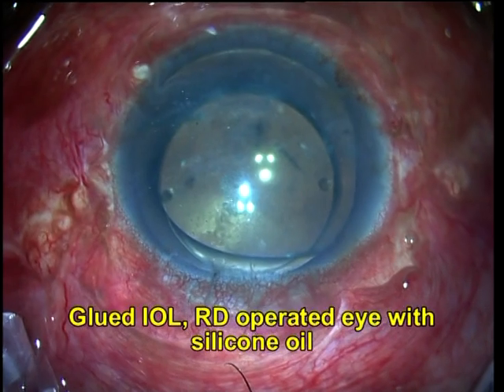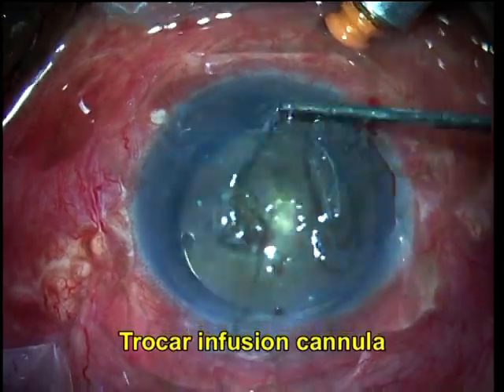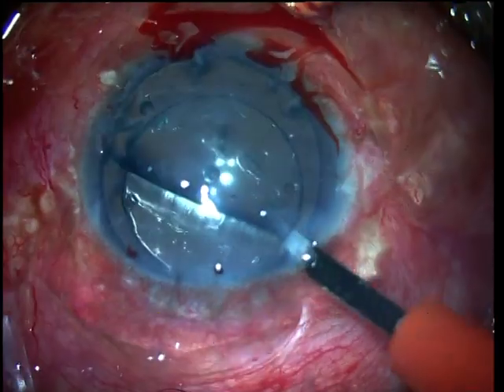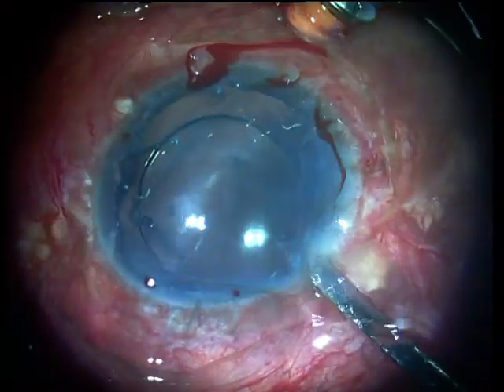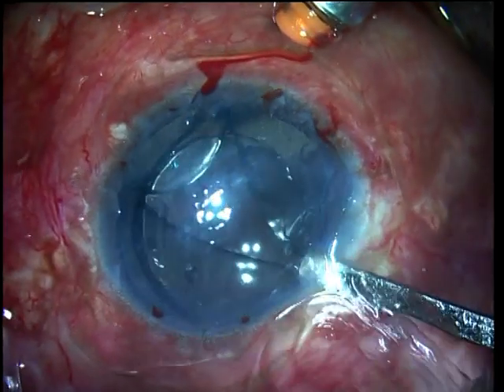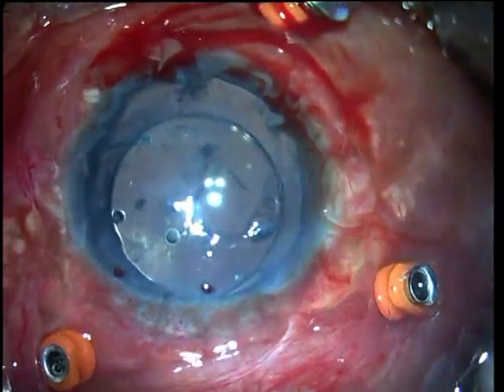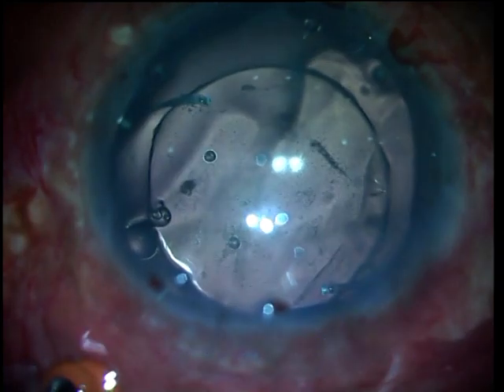Single pass 4-throw pupilloplasty was just started for closed-angle glaucoma. In this case, there is silicone oil in the eye. We fixed an infusion cannula. If you notice carefully, the iris is stuck to the cornea — there is total closed-angle glaucoma. We are making a small incision in the clear cornea and removing the silicone oil. The fluid is continuously going through the infusion cannula. Most of the oil has come out. If there is need, we can also go through the pars plana to remove the remaining silicone oil. Using the pars plana trocars and sucking out the silicone oil, you can see the silicone oil removed completely.